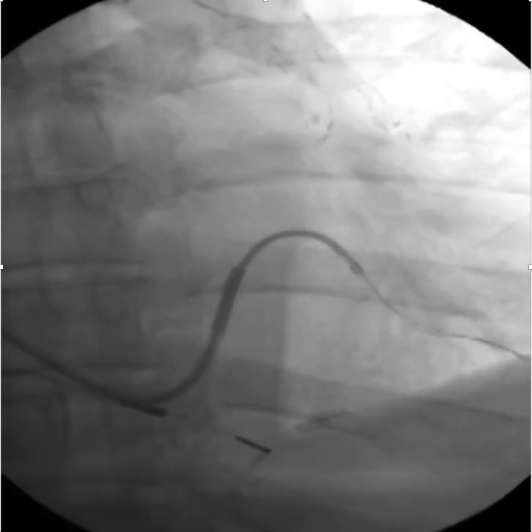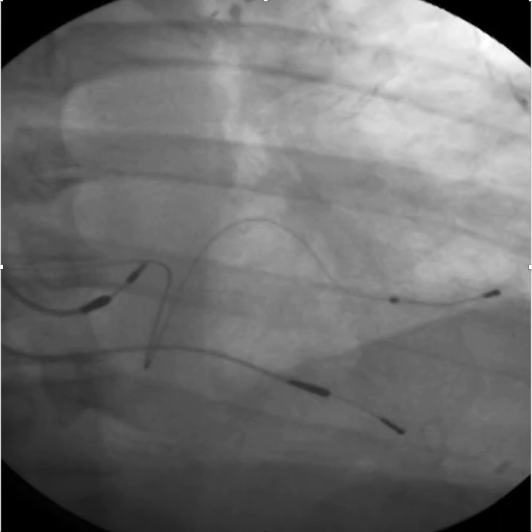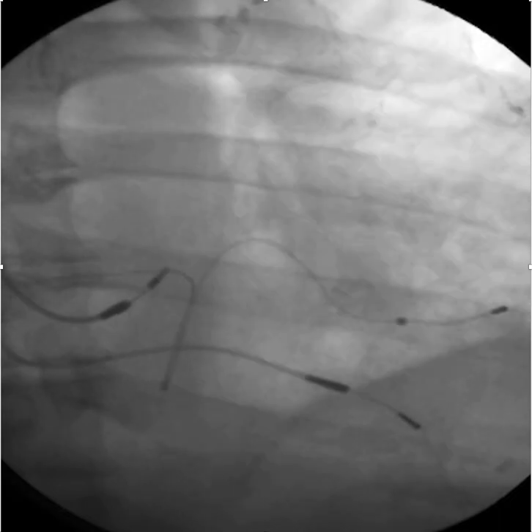From there the LV lead implantation was relatively easy. The patient was really headed for an epicardial lead without the use of these interventional techniques. Thank you for your interest.